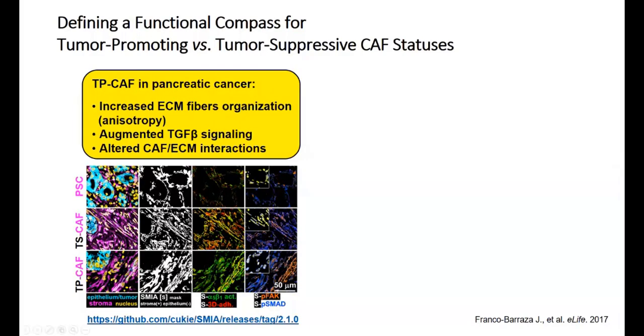What you can see here is our beginnings doing multiplex staining. I remember at that time we probably had 7 or 8 markers. That was the maximum that we were able to detect. And with a very simple yet efficient code, that you have the link to here, we were able to start gating amongst the cell populations based on the expression of markers. This is the early version of what Visiopharm is now able to provide us.